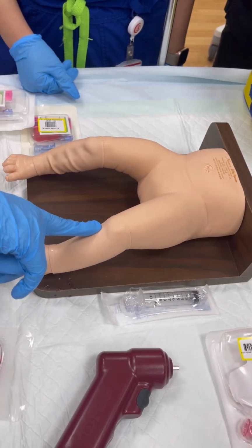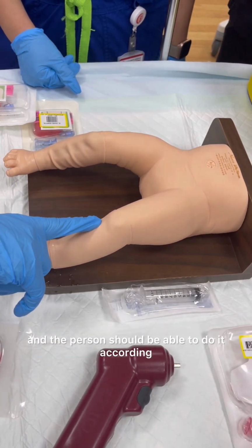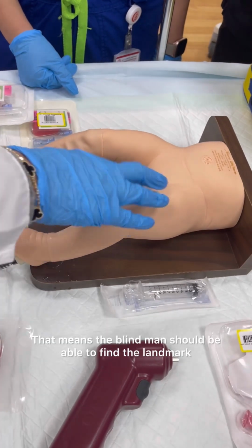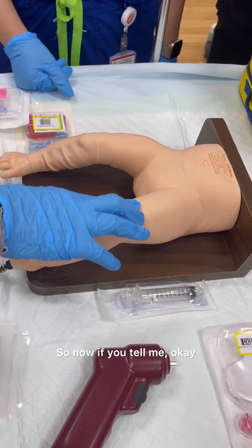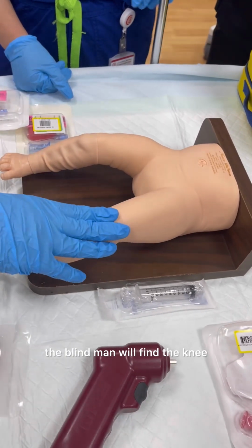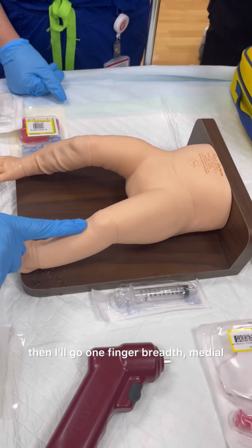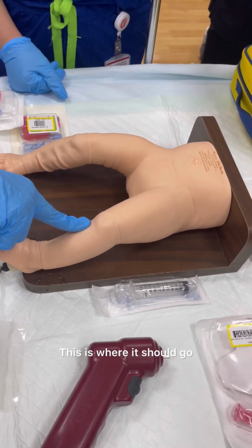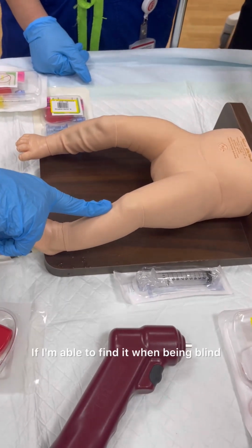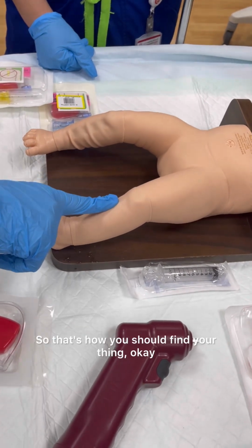Whenever you're directing anybody, you should imagine your eyes closed, and the person should be able to do it according to your instructions. This is how you will know where to put it. The blind man should be able to find the landmark. If you tell me to find the knee, then I will find the tibial tuberosity, then go one finger breadth medial. This is where it should go. If I'm able to find it while blind, that means your instructions are good.